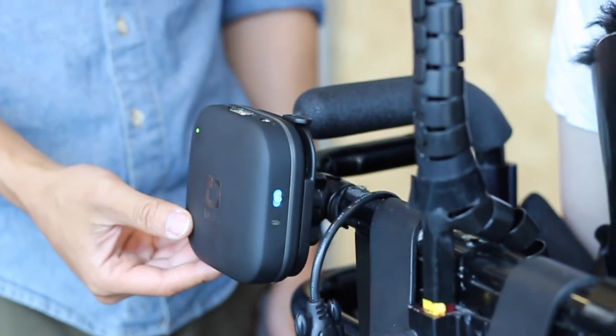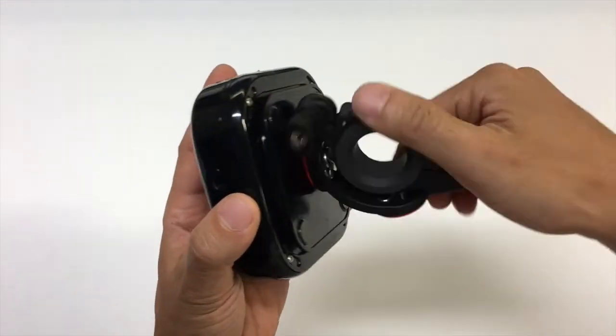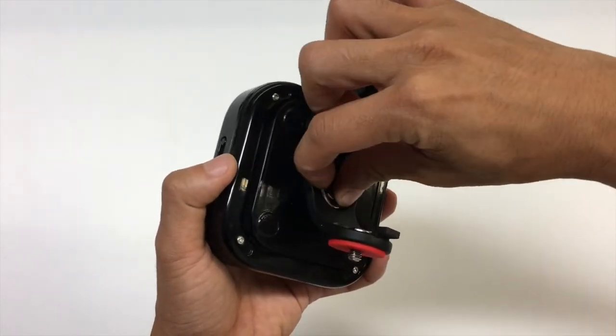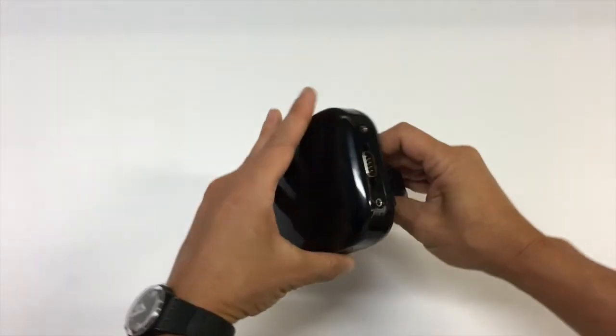You can now turn on your Tekla-E and begin the setup process with your device. The bottom of the Tekla-E also features a standard quarter-twenty camera mount thread. This can be used to mount the Tekla-E on a variety of accessory mounts that are used for bicycles and camera equipment.